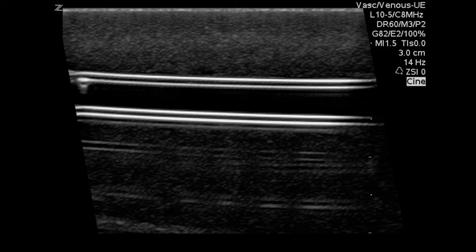This is what it looks like when we're imaging it. We're using a linear array probe and you can see the vessel in a transverse plane. You can see the nice thick echogenic walls and anechoic lumen. You can also see in the deep field the groove where the phantom sits on the arm as an analog to your humerus. In a sagittal plane we can see those thick echogenic walls of the blood vessel and anechoic lumen along with the soft tissue density phantom material above and below it.